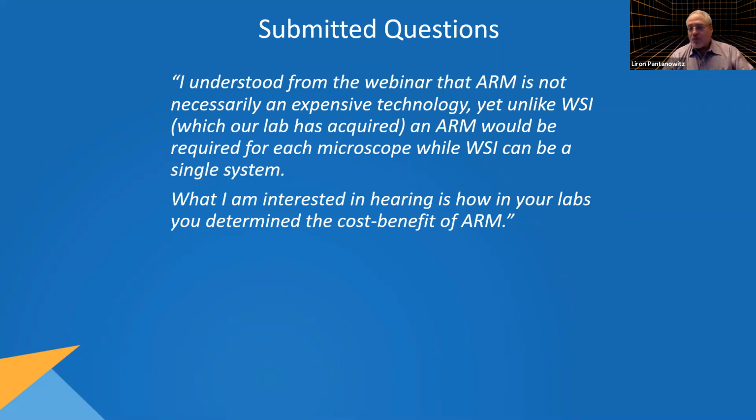Whereas today, every pathologist in the world has a microscope. If you're an anatomical pathologist in one form or another, even a microbiologist, you already have a microscope. So that's already done. And not every pathologist in the world has a WSI system. In fact, I think it's going to be more than a decade before everyone gets a WSI system. I'm talking in developing countries too. Today, I think I could walk into any country in Africa where there's a pathologist practicing, and they wouldn't be practicing if they didn't have a microscope. So they already have a microscope.